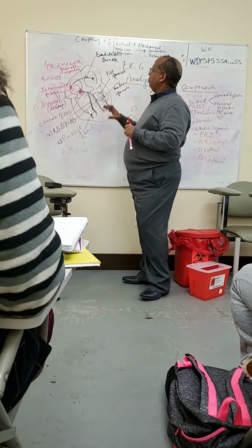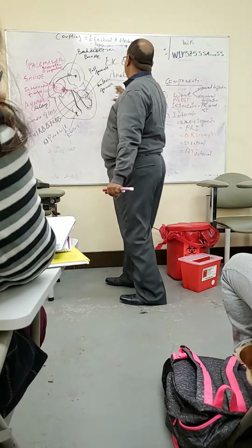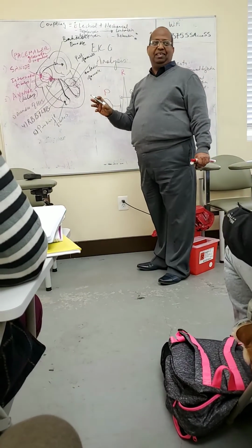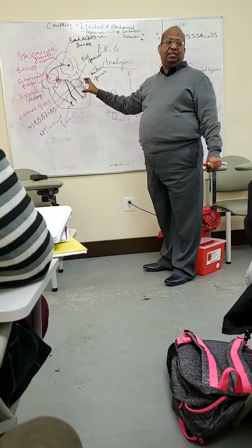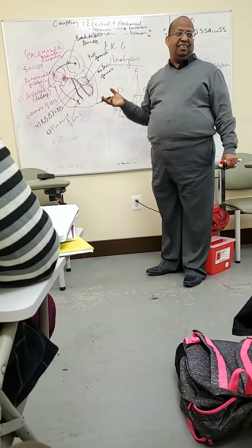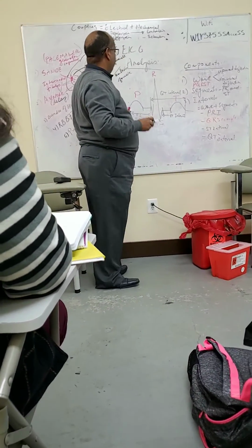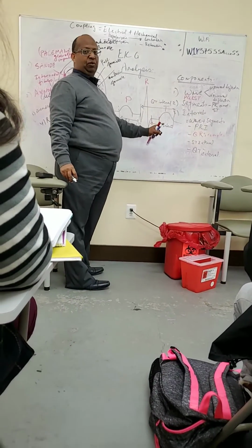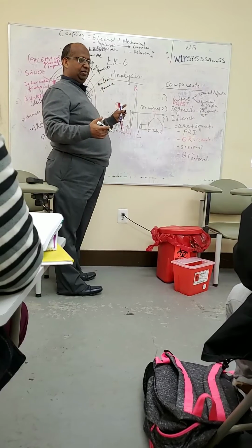Okay? So once we know this, when we come to this, how do we relate it now? I got my EKG tracing. How do I relate this with these activities? That's the question. Knowing this will help me understand, interpret and analyze this stuff. That's why I start from here before I go to all the details of the analysis.